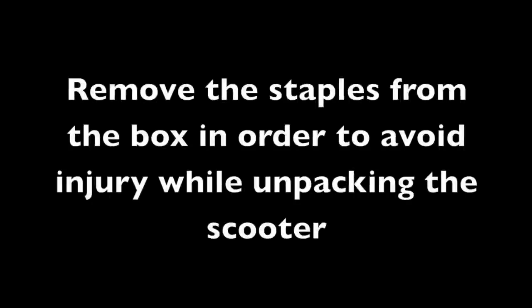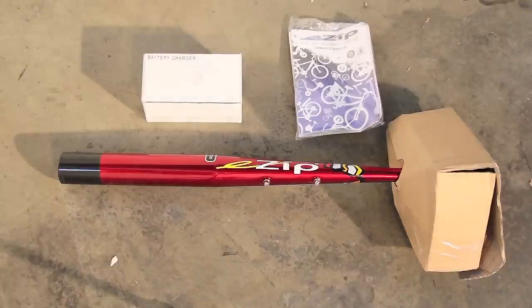Unpacking your scooter. Remove the staples from the box in order to avoid injury while unpacking the scooter. Remove the charger, owner's manual, and seat tube from the box.